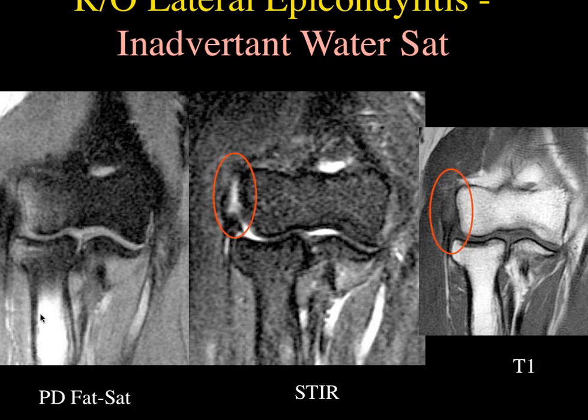If we do a knee study and there's an ACL and they use metal interference screws, then we always ask them to add a stir sequence because it's much less sensitive to metal artifact. The other area is most of our protocols dealing with the periphery outside of the knee, like the foot and ankle.